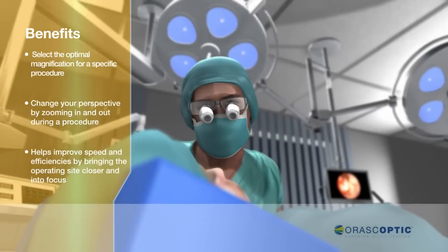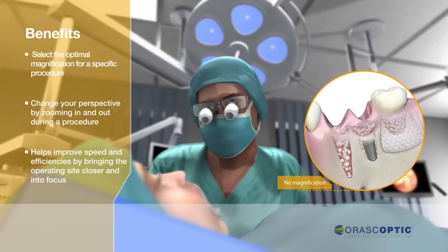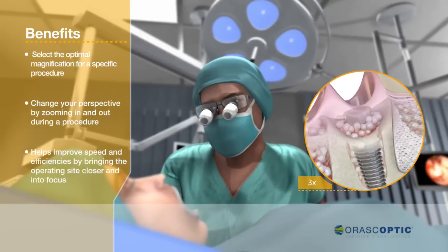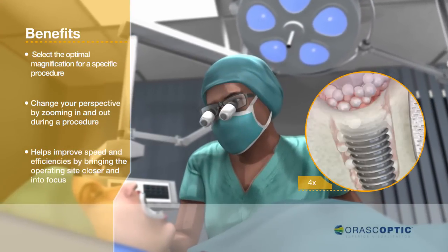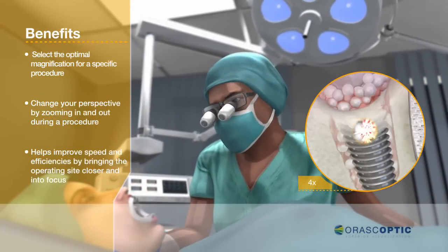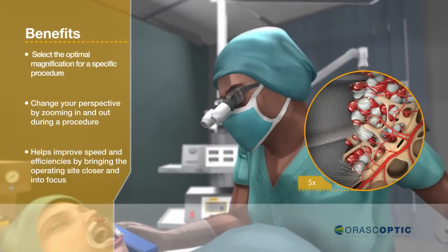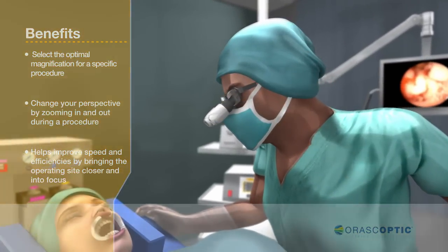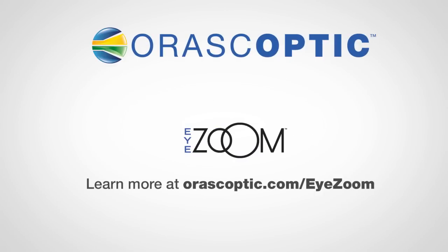The unprecedented versatility of the EyeZoom allows you to select the optimal magnification for a specific procedure, or to change your perspective by zooming in and out during a procedure. This flexibility helps improve speed and efficiencies by bringing the operating site closer and into focus. Learn more about EyeZoom at orascoptic.com/EyeZoom.